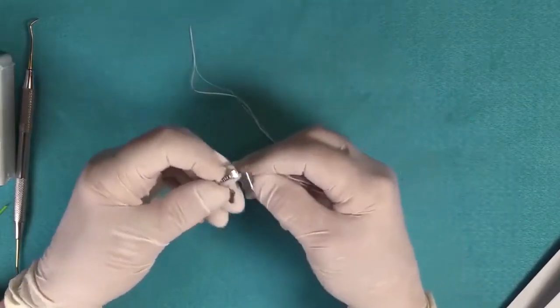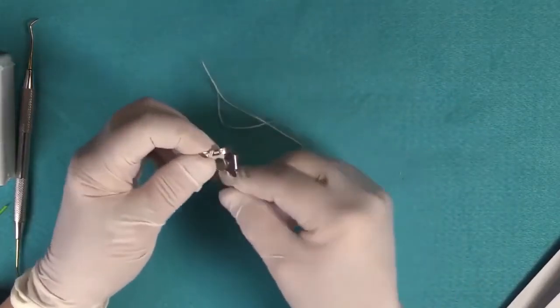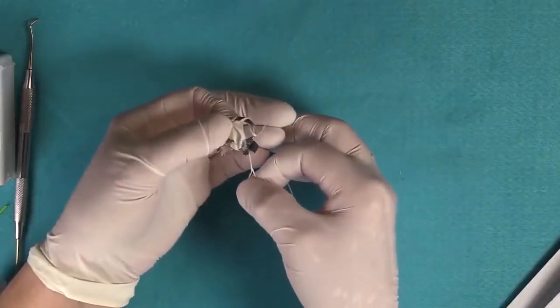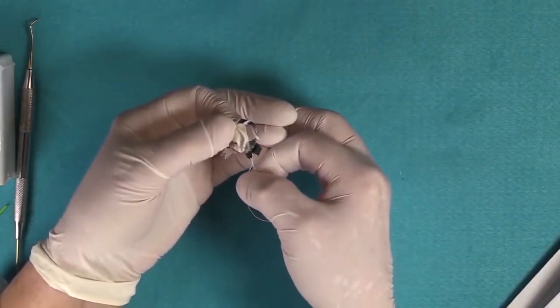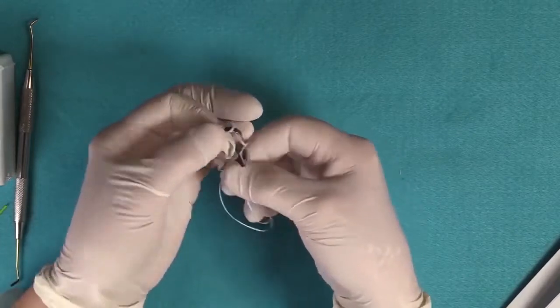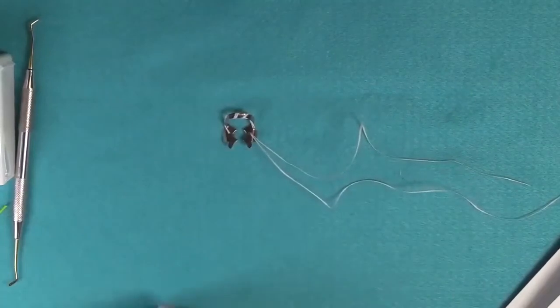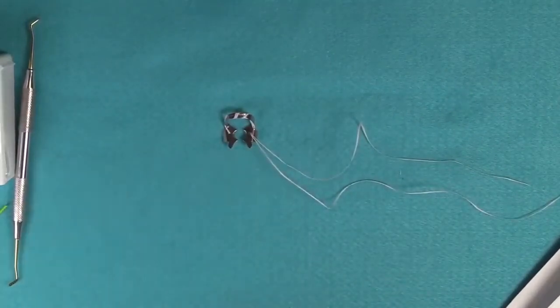And then we're going to take the floss and wrap it 3 times across the bow. And then we're going to thread it from bottom to top. There we go. Well, that makes perfect sense. Now, no matter what happens, you've got it. Right, if it breaks on you, you have the whole thing.